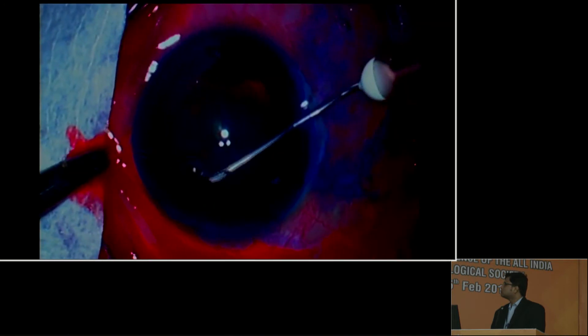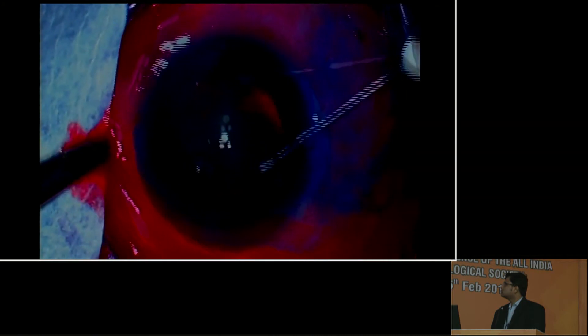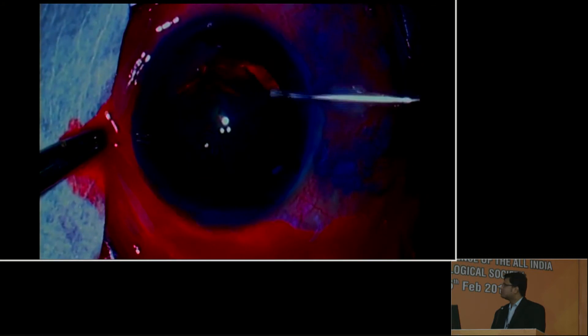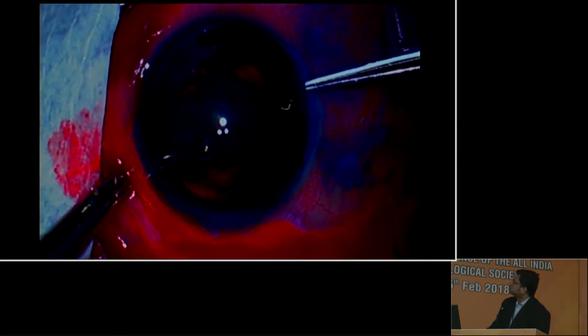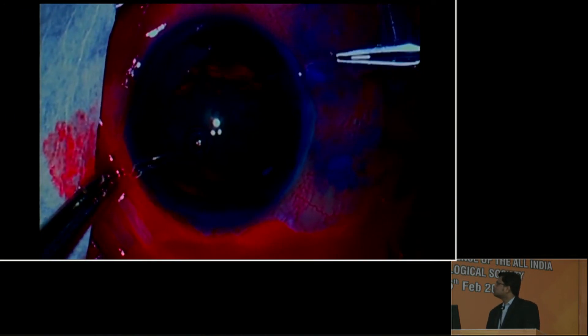After constructing the 7mm sclerocorneal tunnel, the anterior capsule was stained with trypan blue and continuous curvilinear capsulorhexis was done. The anterior capsule was taken out and preserved in balanced salt solution. A piece of anterior capsule is then trimmed to a size bigger than the macular hole.